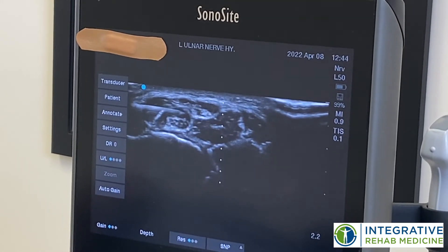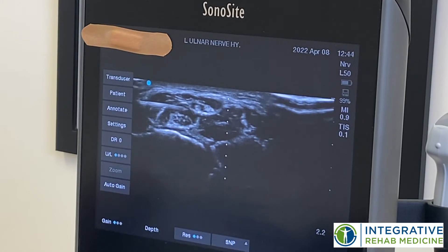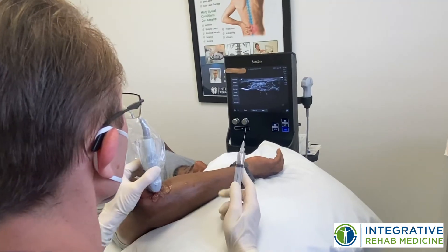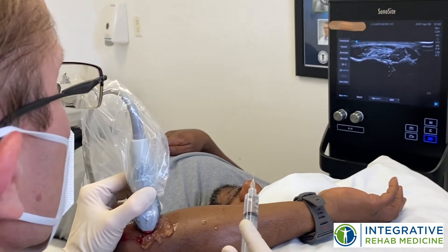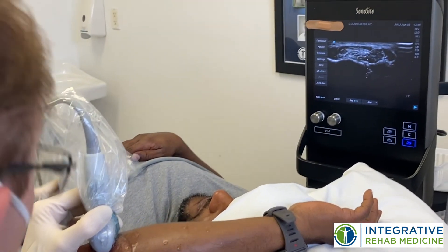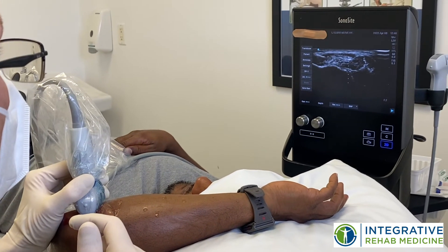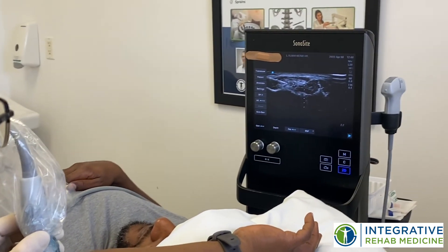I'm decompressing it and you can see the nerve move away from the muscle. Here's the nerve again, just a little bit distal to the elbow underneath that flexor carpi ulnaris again. There's my needle right there — I'm going to get a little close to the nerve.